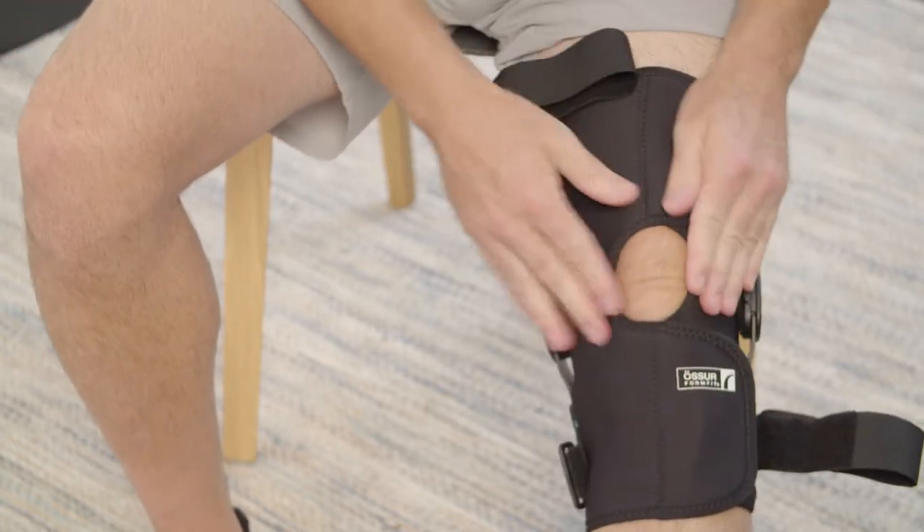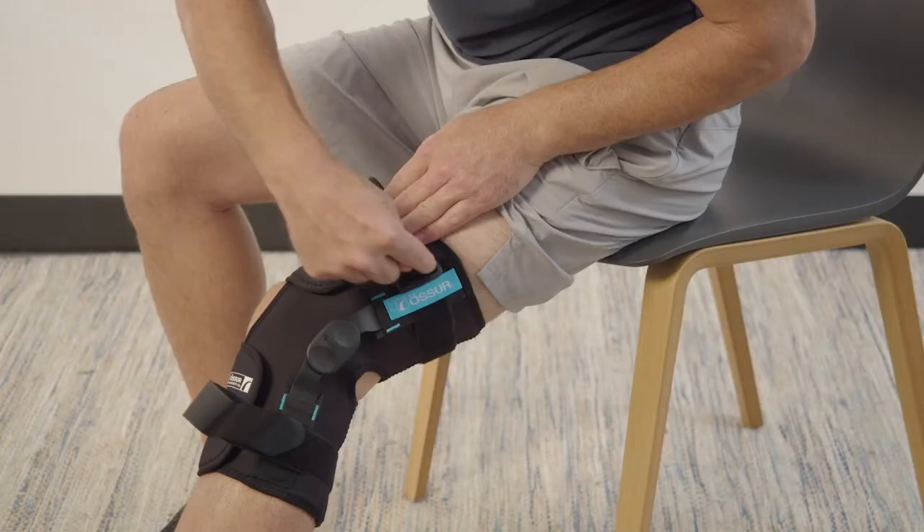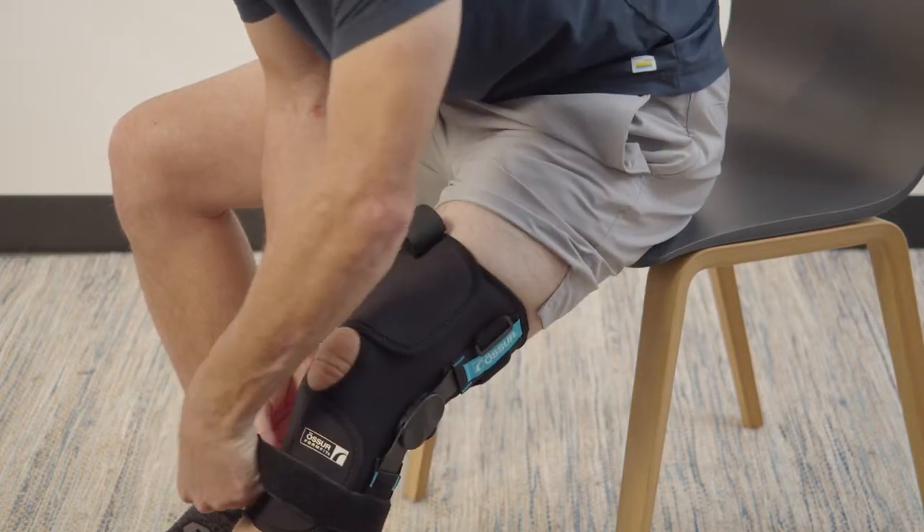The patella opening should be centered over the patella and hinge aligned with midline. Then fasten calf strap and then thigh strap.